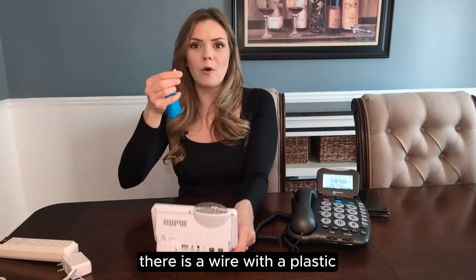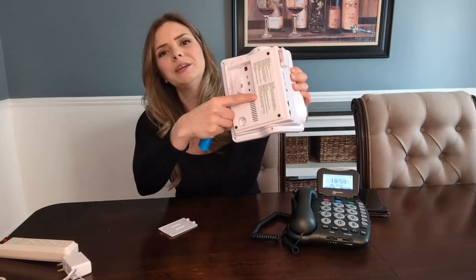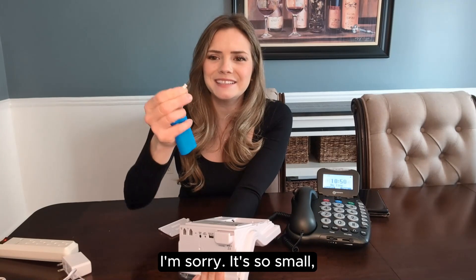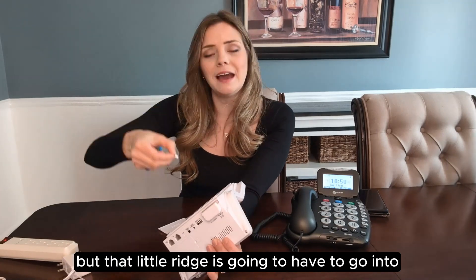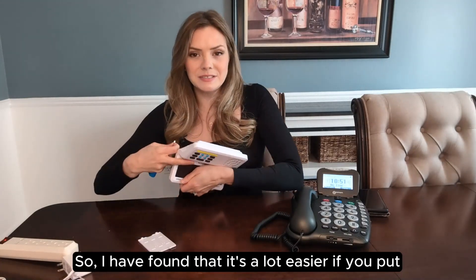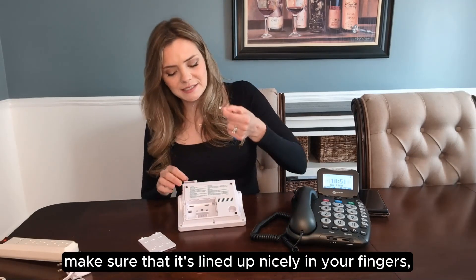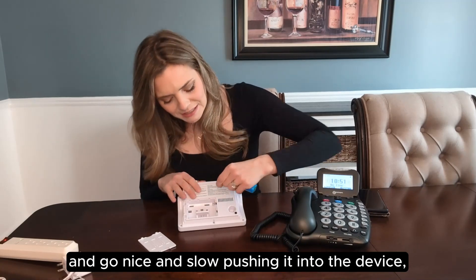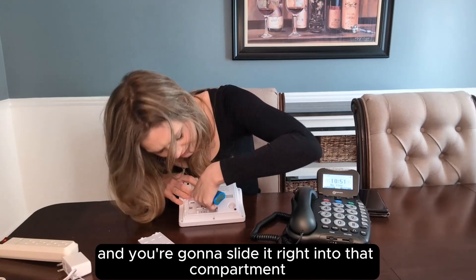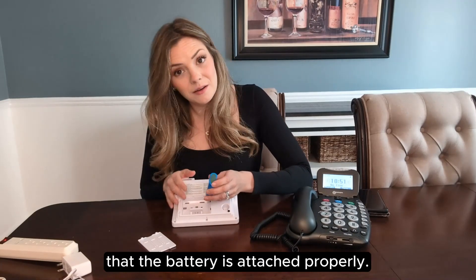If you pull it out, there is a wire with a plastic end right here that we're going to attach into the compartment on the device. It's right here in this inside corner and there's a little plastic ridge. On that little ridge it's going to have to go into the opening on this compartment. I have found it's a lot easier if you put the device down on the table. Make sure it's lined up nicely in your fingers and go nice and slow pushing it into the device, then slide it right into that compartment and give it a little tug just to make sure the battery is attached properly.